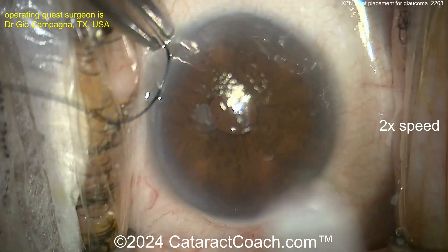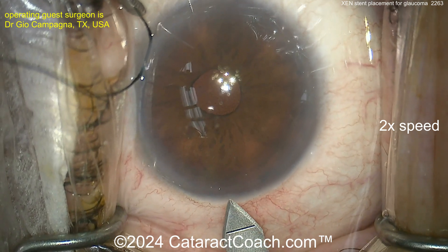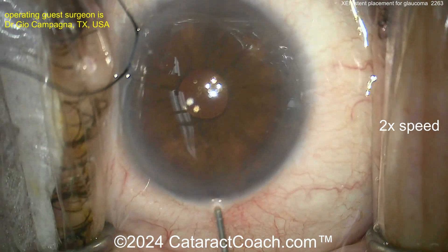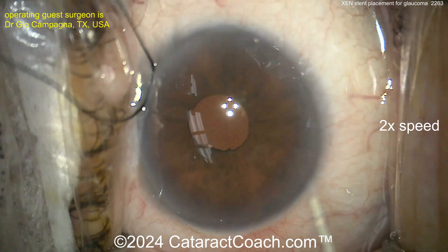With the traction suture in the eye, it's now time to place the Zen stent, so making an incision here. You can do this Zen stent with: number one, an ab interno closed conjunctiva primary needling like this video; you could also do an ab interno open conjunctiva; or you can do an ab externo open conjunctiva.